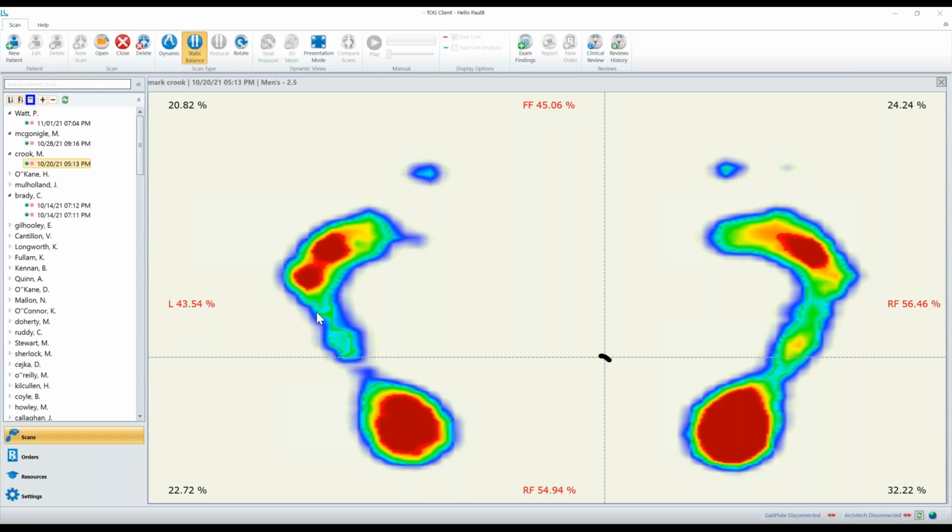Whether it's weakness through the glutes, whether it's a Trendelenburg drop on one side and non-neurological, whether it's a sacroiliac joint rotation, whether it's a pain avoidance pattern, whether it's an anatomical leg length. But again, this indicates that there's a need for a more in-depth assessment to identify why the anomaly is there and it needs to be treated.